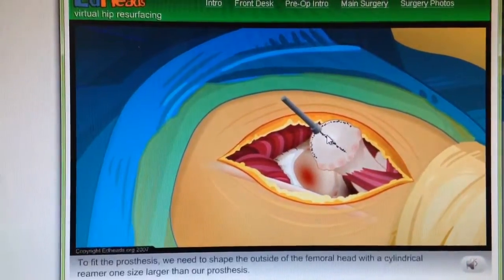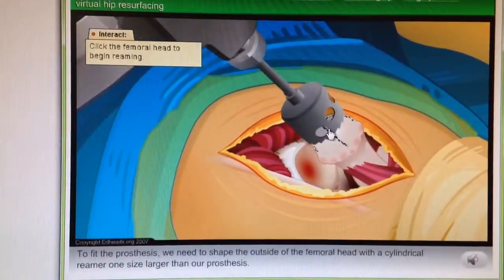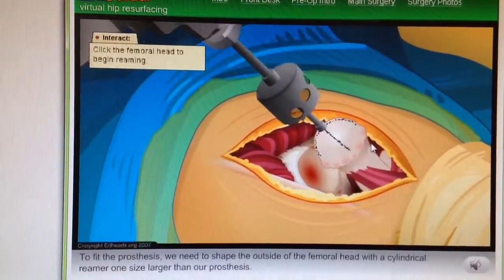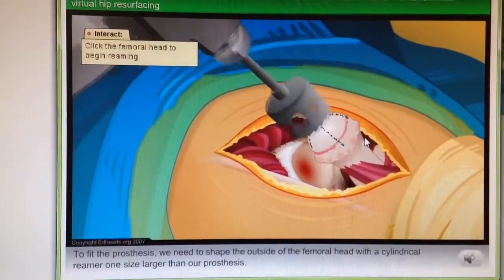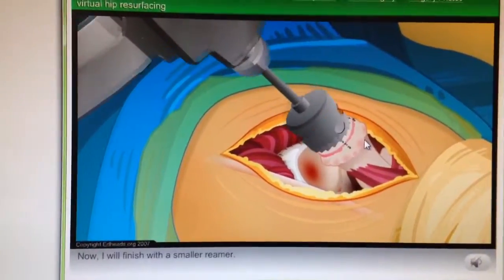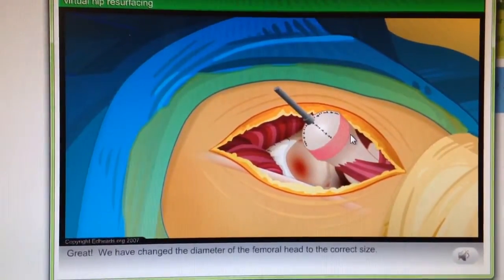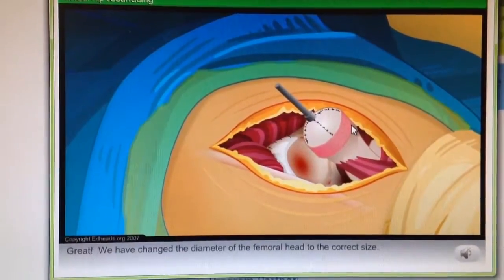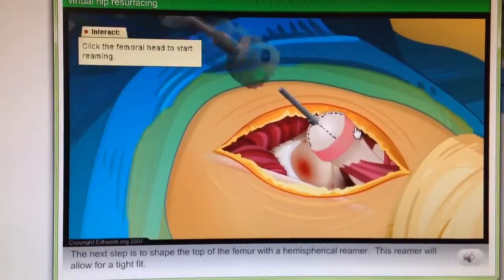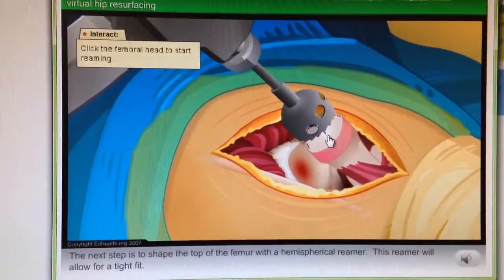Good job. To fit the prosthesis, we need to shape the outside of the femoral head with the cylindrical reamer one size larger than our prosthesis. Good job. I will finish with a smaller reamer. Great! We have changed the diameter of the femoral head to the correct size. The next step is to shape the top of the femoral head with the hemispherical reamer. This reamer will allow for a tight fit.